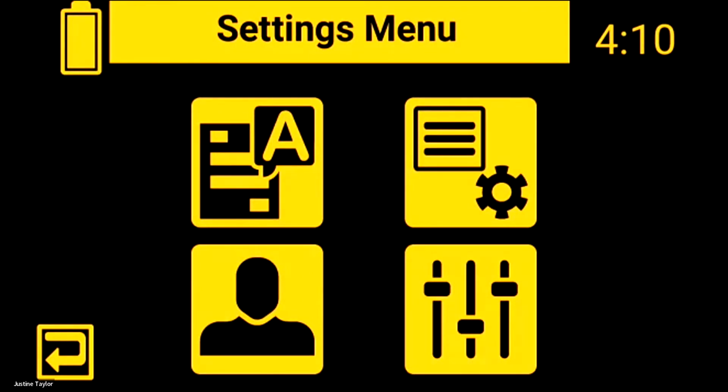So you're wanting to turn off the spoken menus. So you go to the settings and menus. Settings. So again, you have four options here, and like Mike was saying, initially when you're learning the device, it might help to have the spoken menus on, but once you've used it for a while and you know where things are, you may not need it as much, so you can turn it off. But just to give you an idea, you've got reading settings, and then user settings below that, and on the right you have menu settings, and then the bottom right of that square is your system settings.